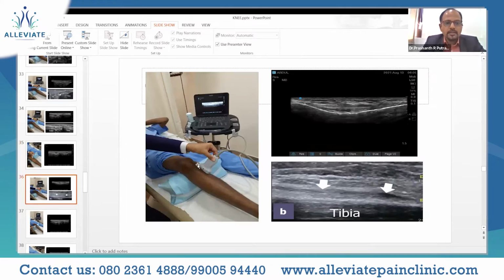So from there, sliding down further, we are able to reach the tibial portion, and then here we are looking for the pes anserine bursa. Only if it is inflamed or any bursitis is there, then it is visible, or else it is visible as a thin hypoechoic to hyperechoic line beneath the tendons. Which tendons? The three important tendons: sartorius, gracilis, and semitendinosus, the GST mnemonic.